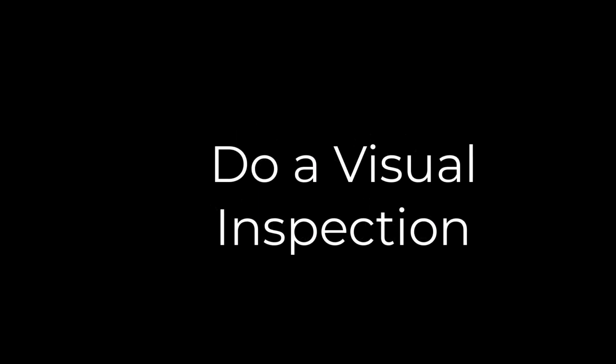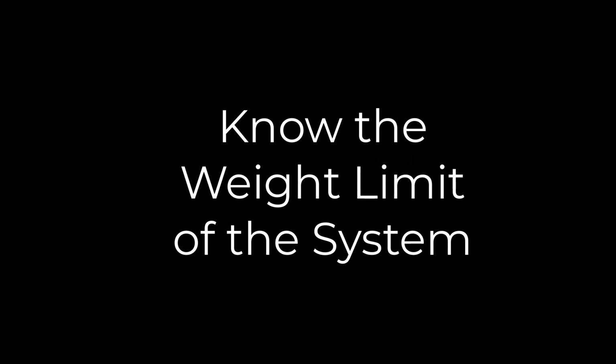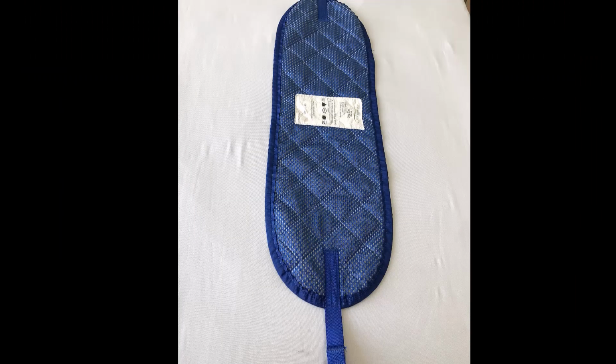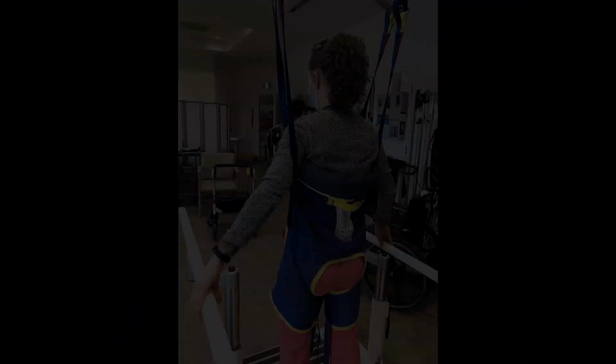In summary, before you use the lift, remember these steps. Do a visual inspection. Know the weight limit of the system, the motor, tracking and sling. Inspect the sling strap for wear. And check the charge level of the motor. The third component of the overhead lift systems are the slings. Please refer to our Island Health overhead lift slings video for in-depth discussion on the many types of slings available.